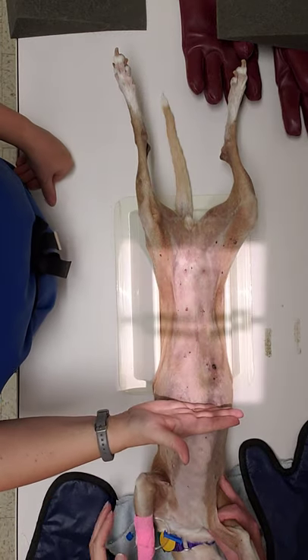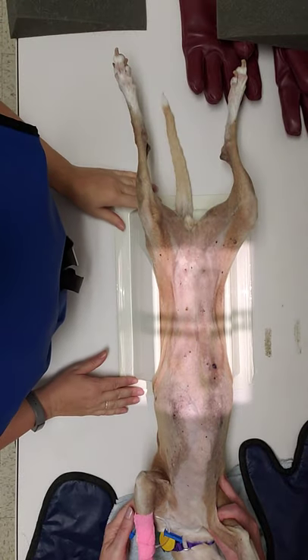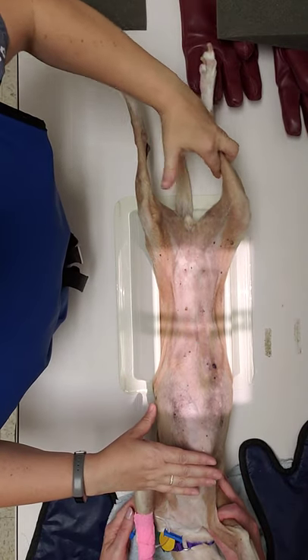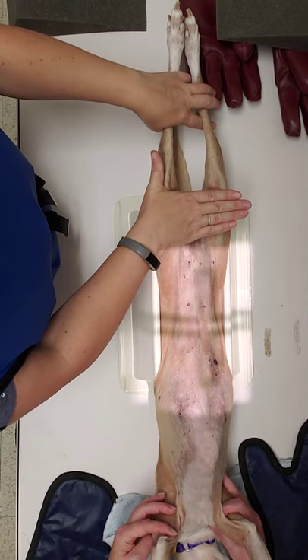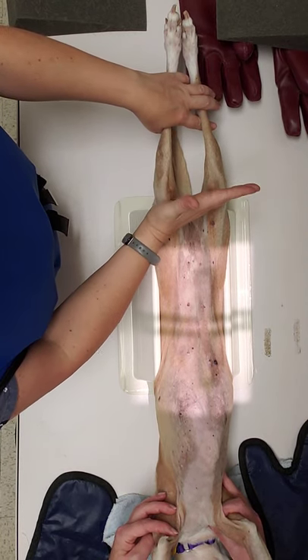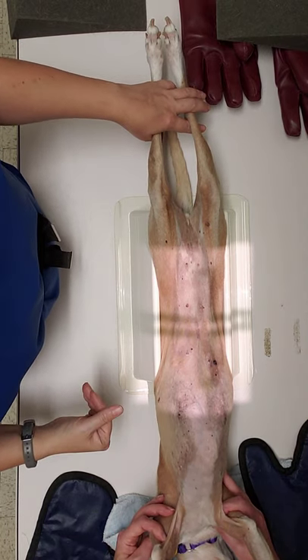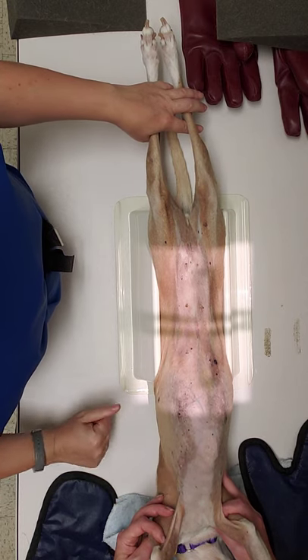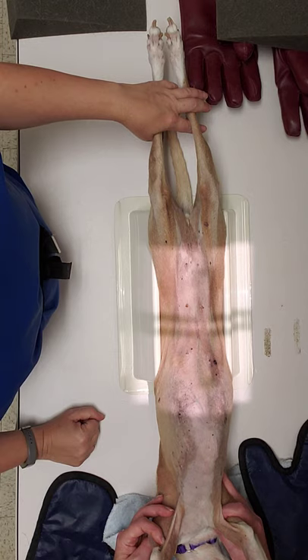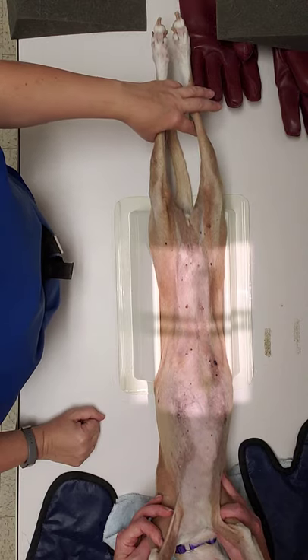Your lateral mark edges are going to be about an inch on either side — we're a little wide so I can bring that in. You're going to want to make sure you can extend her back legs evenly, both ways. Any crookedness will put an S-curve into her spine and also shifts everything in her abdomen. Her front legs are going to be extended forward, and you want to take this on full expiration. And there is your collimation and positioning for your VD abdomen.